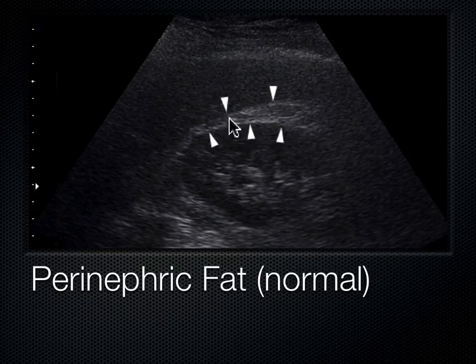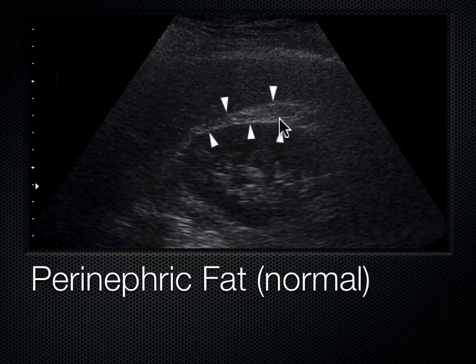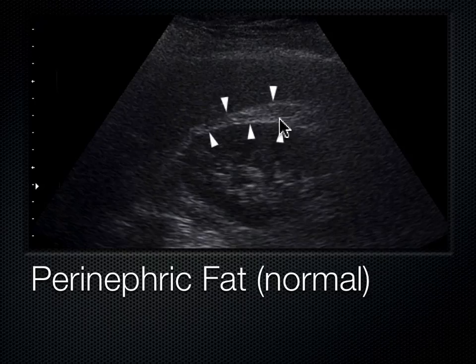A common finding is a hyperechoic separation between the kidney and the liver or spleen — that's perinephric fat, a form of visceral body fat seen around the kidneys, blood vessels, and the heart. You can't predict based on body habitus whether someone will have a large perinephric fat pad — someone could be very thin and still have significant perinephric fat. We don't control it much through diet.